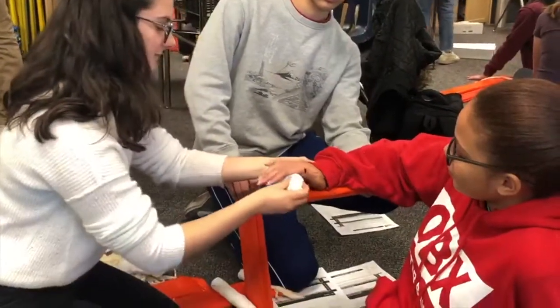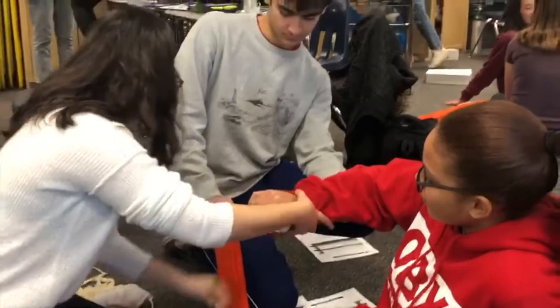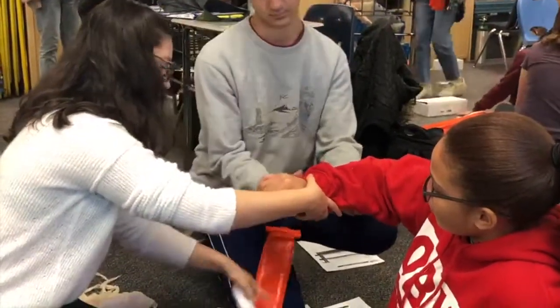Then you're going to ask her to grab that. There you go. And then you're going to put two hands — you don't need that one.